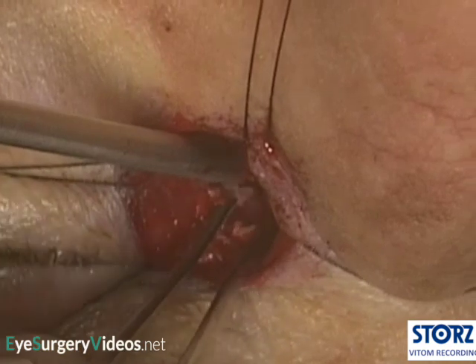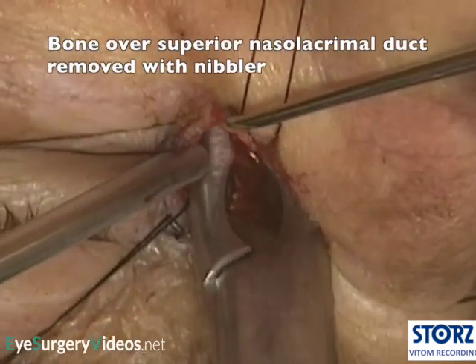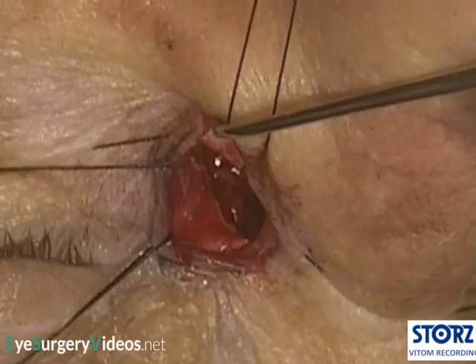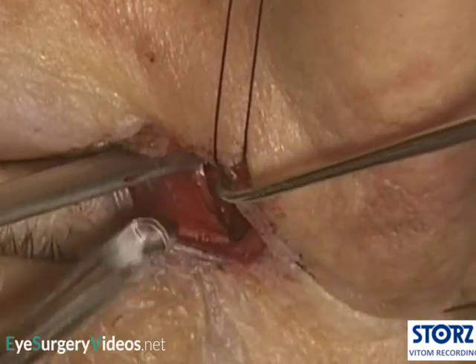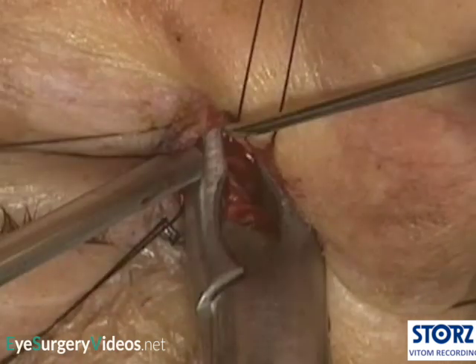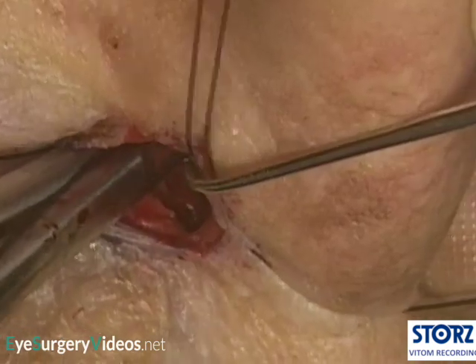The inferior aspect of the lacrimal sac can be fully opened if some of the maxillary bone overlying the superior aspect of the nasolacrimal duct is also removed. A nibbler is a useful tool for this and is carefully slid over the bone with nasolacrimal duct anterior to one prong and nasal mucosa posterior to the other prong, as always, ensuring that the nasal mucosa is not trapped.